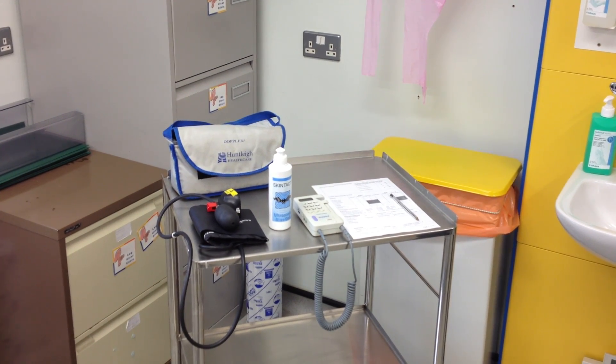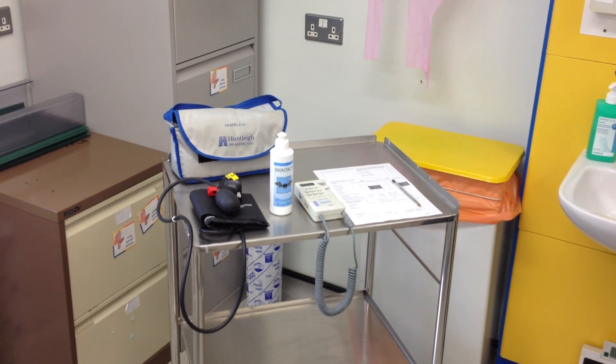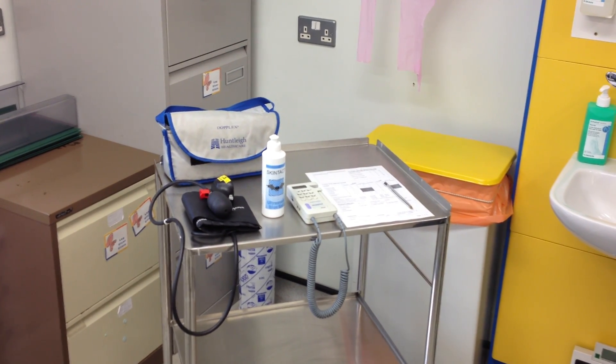We're now going to perform an ankle brachial pressure index test. This is the kit that we commonly use: an appropriately sized adult blood pressure cuff, some coupling gel, a handheld Doppler unit, and some documentation to record the results.